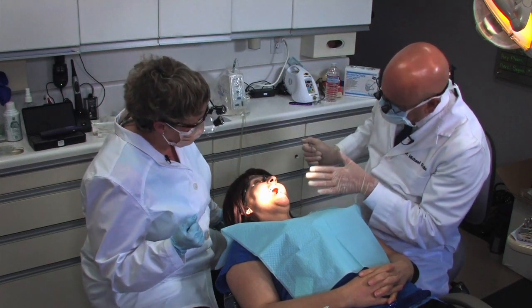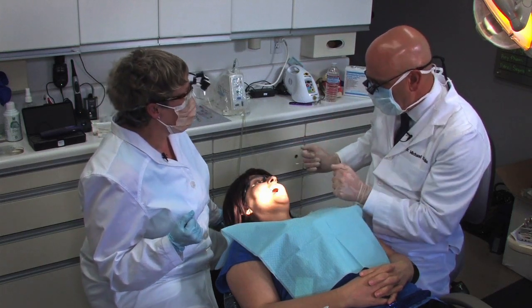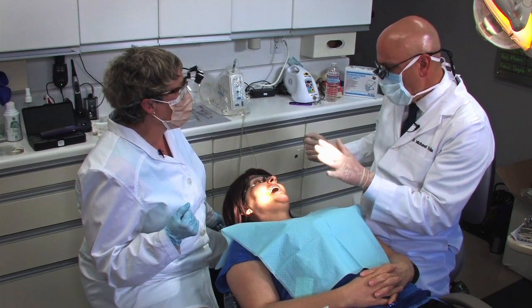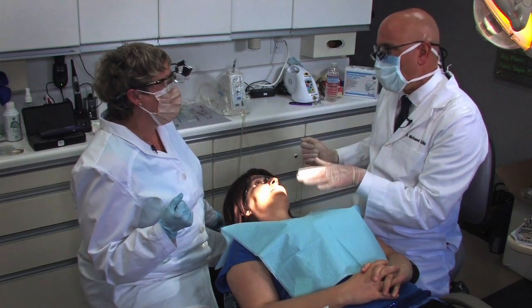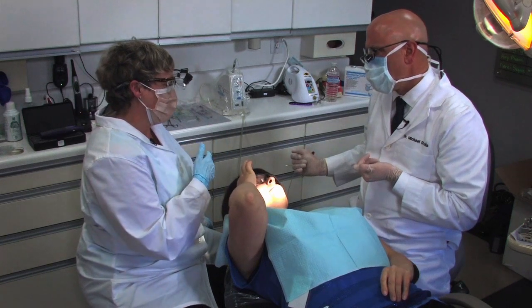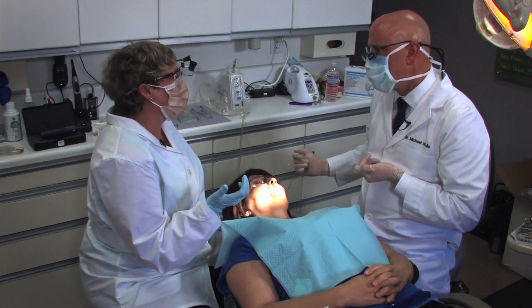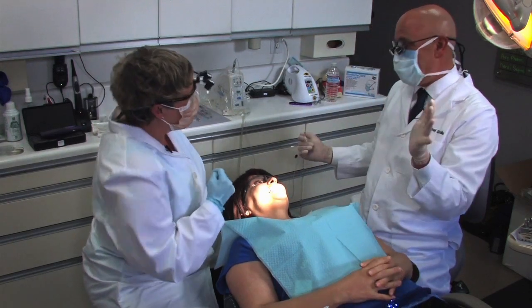Considering that's the first time I've done that injection, unlike the Gow-Gates, there's not that feeling of not knowing where you are. You always know where you are during this and just watch the progression of the blanching. I think a lot of dentists hesitate — including myself — to do a palatal injection if it's not necessary, but when I compare it to going around and doing infiltrations on all the teeth, even though it's a palatal injection, it's so much more pleasant for the patient. Just two injections rather than 10, and barely under two cartridges versus that whole bulk of anesthetic. The time taken here is just for the tissue to accommodate the solution; with the other technique you're making additional micro-trauma with each penetration. Overall it probably takes the same amount of time, or even faster — I'm sold on this. You're changing the way I do local anesthesia, and that's good!